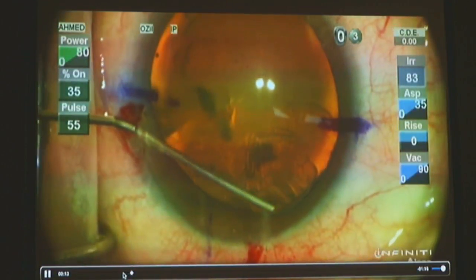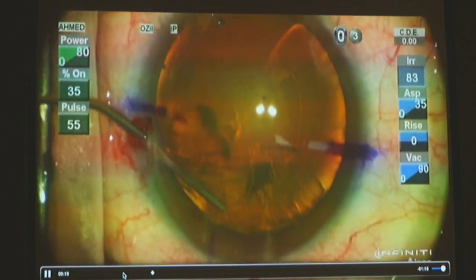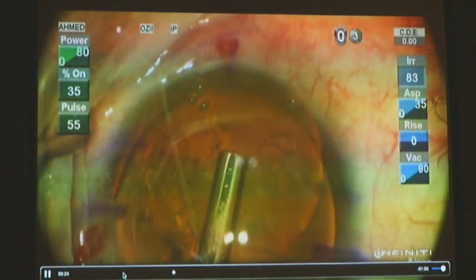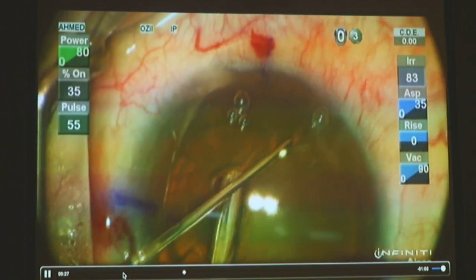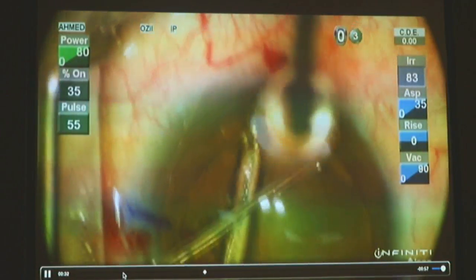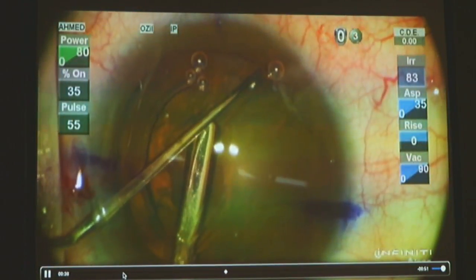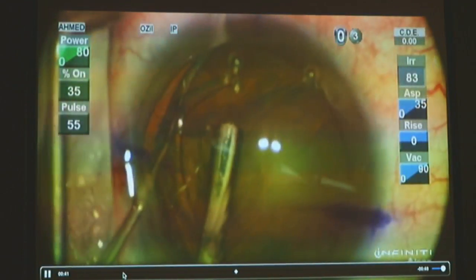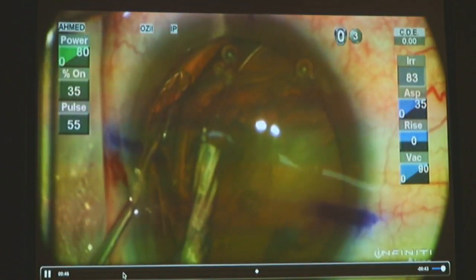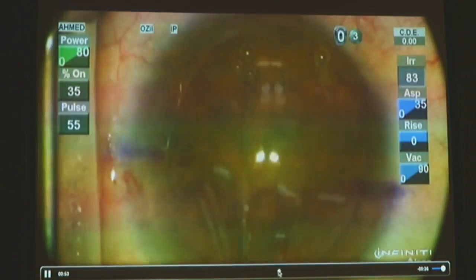In this case, which I classified as mild disease, I'm using viscoelastic to viscodissect and separate the cortex from the capsule to prepare for the injection of a capsular tension ring. Remember, this ring works by essentially spreading the forces around the capsular bag, allowing it to support areas where the zonule is weak by spreading the tension around, and a centrifugal force to maintain capsular bag conformity and circularity of the capsular bag.